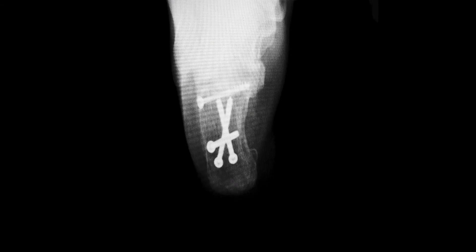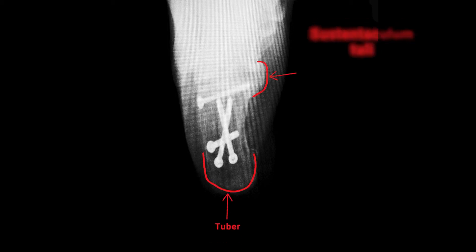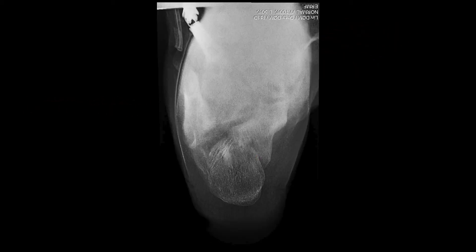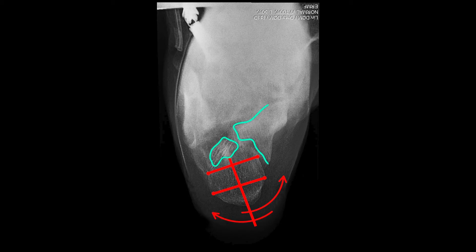At a well-done axial view, we can observe the calcaneal tuber, sustentaculum tali, and subtalar joint. In cases of fracture, you can see deviation of the tuber — varus or valgus. We can also observe intra-articular fractures and estimate the degree of displacement of intra-articular fragments.